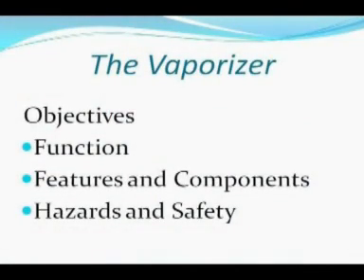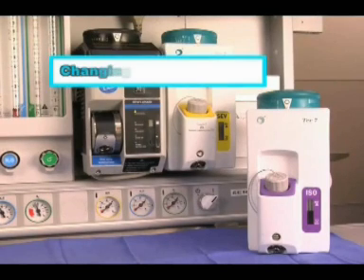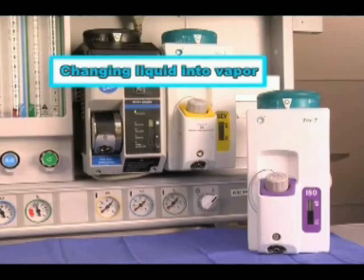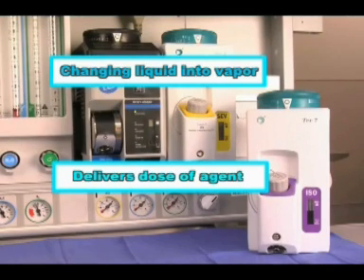Vaporizers. In this module, we will be discussing the function, major features, hazards, and safety of the vaporizers. Important functions of the vaporizer include changing the liquid anesthetic agent into its vapor state and delivering the specific dosage and concentration of the agent into the gas mixture.